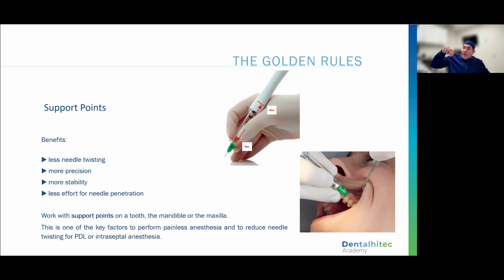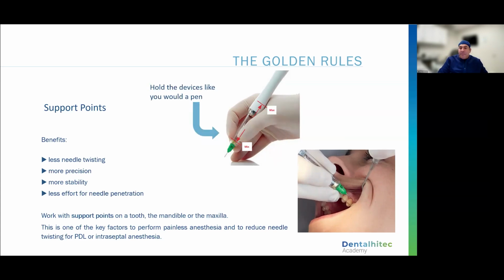If you don't have proper finger position, you can see here, doctor does a good job. They have a nice stable base. You're more likely, as you exert pressure, to bend and to move. And if you do that, you're going to bend a needle. If you learn to hold close to the hub and direct parallel forces down the long axis of your unit, the chances of bending a needle for a patient under 14 years of age, even sometimes older, are very, very low. Okay?